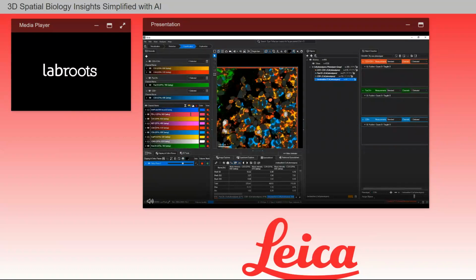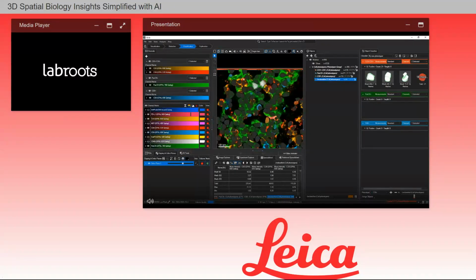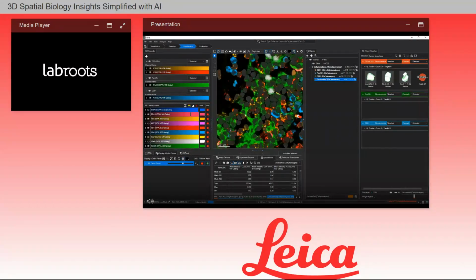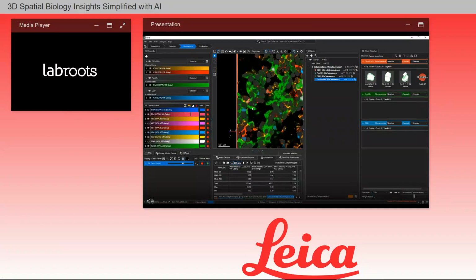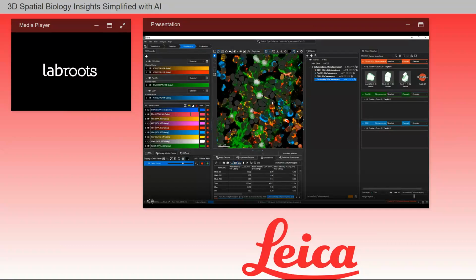When I'm done with selecting the cells, I will right-click on one of the cells and select Assign Objects to CD3, CD4 positive phenotype in the context menu. This puts all of the cells I've selected into the training data for the CD3, CD4 phenotype. Now, I'm going to do the same for pan-CK. Typically, you will need at least 5 or 10 cells per phenotype to get a good phenotyper. However, you can update teaching with more cells later if the classifier does not work well for you.